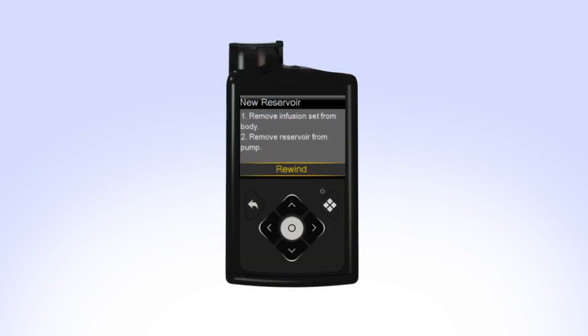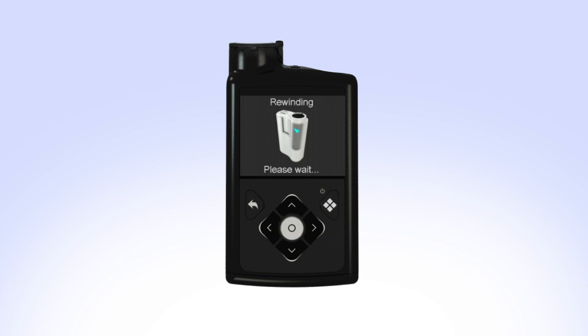On your pump, select Rewind. The rewinding screen will appear while the piston rewinds. Rewind Complete appears when the piston has rewound. You can now set the pump down and prepare to fill the reservoir.